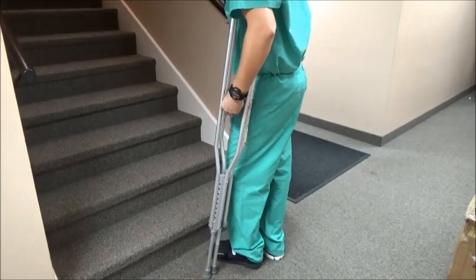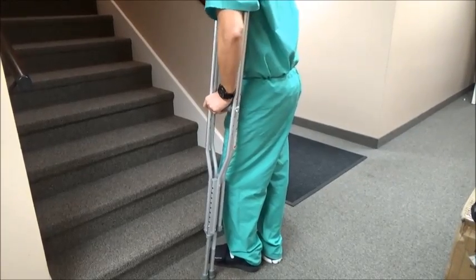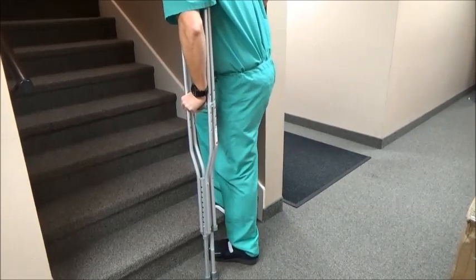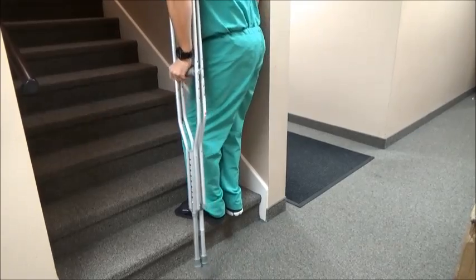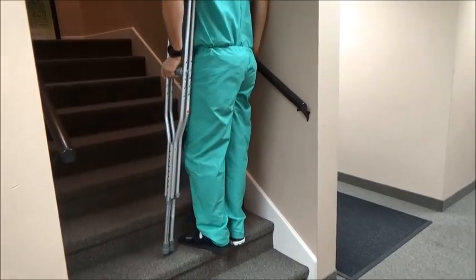Place one hand on the crutches and one on the railing, then step up with the good foot, lifting the weight off the injured foot. Next, bring the injured foot up and then advance the crutch. Continue that pattern all the way up the stairs, making sure not to rush.